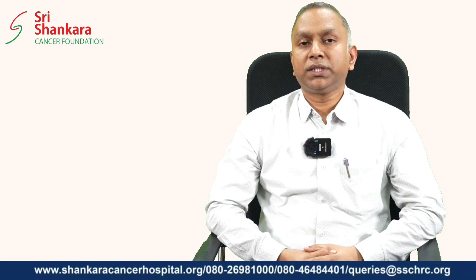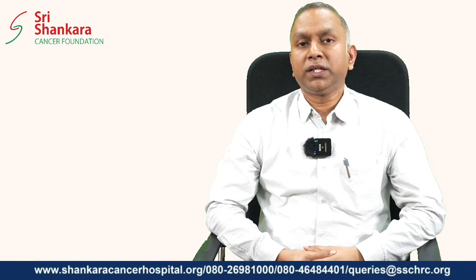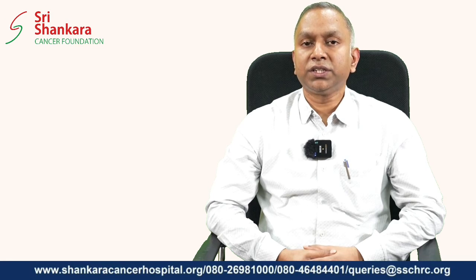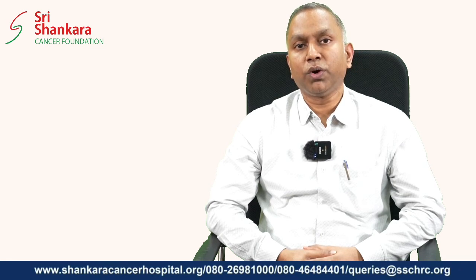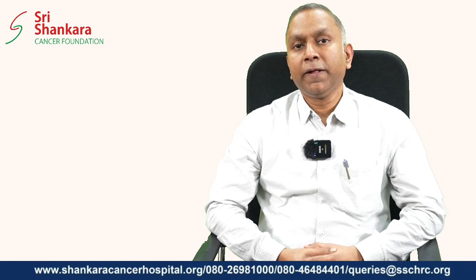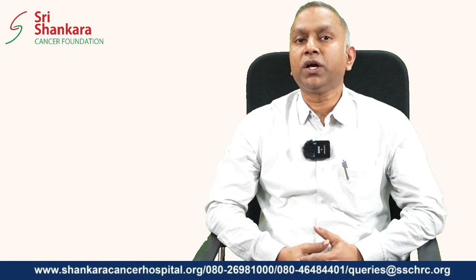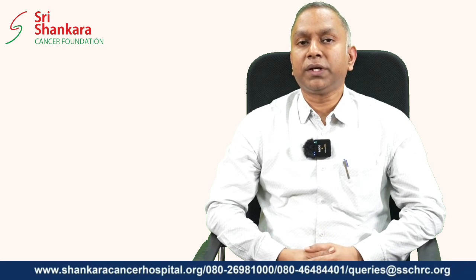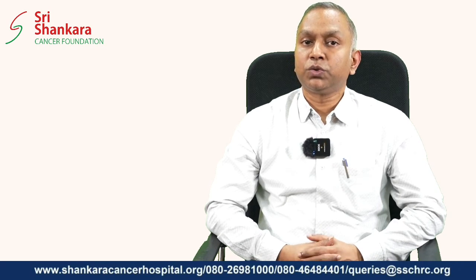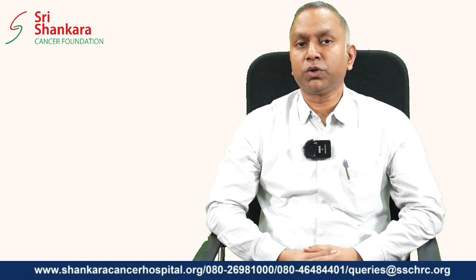Once the procedure is done, we will do a CT scan again, and the radiotherapy will be planned in such a way that the radiation is delivered only to the areas where we want it. There are some critical structures in the prostate, like the urethra, where the radiation should not go. That can be precisely identified on a CT scan, and the treatment can be planned so that there are no side effects with respect to the urethra.